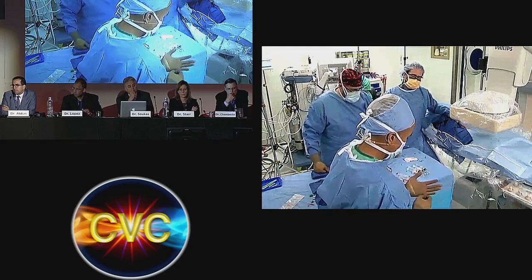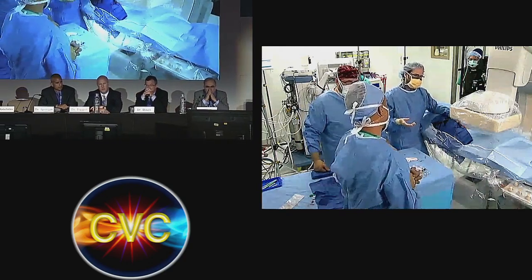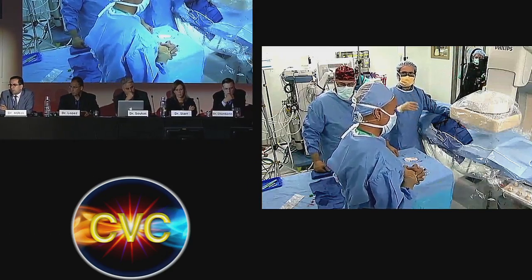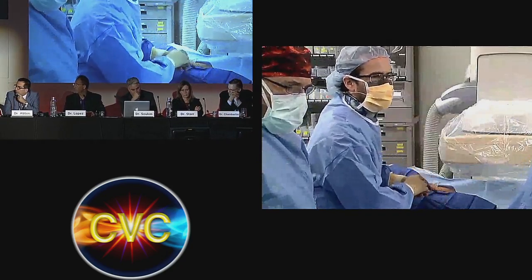Those slow, really controlled balloon angioplasties do work well, and I think it's time for us to re-explore that. But before we go into the PTA and balloon angioplasty technique, I'd really like your thoughts on SFA and popliteal versus are we going to touch the AT or not? Because we're at least 50-50 on that. Miguel?